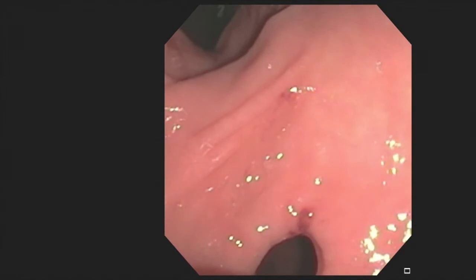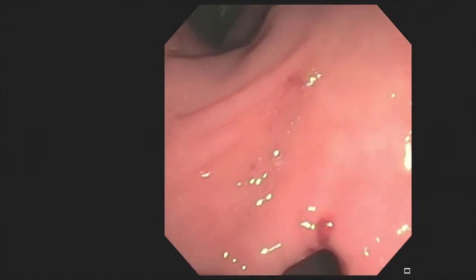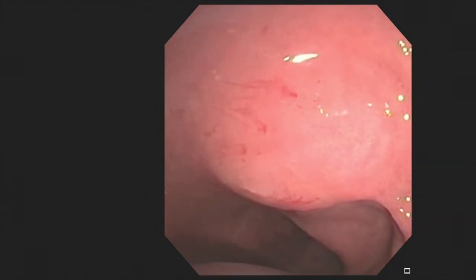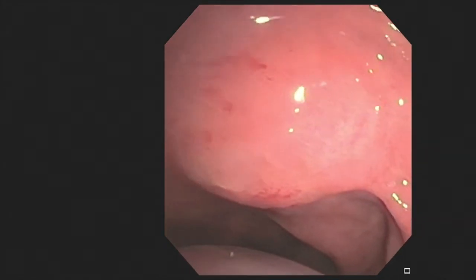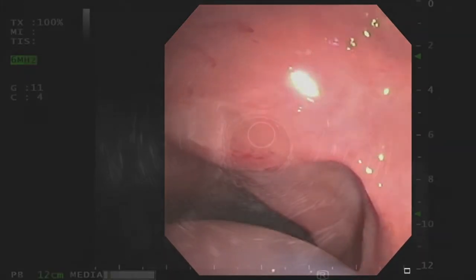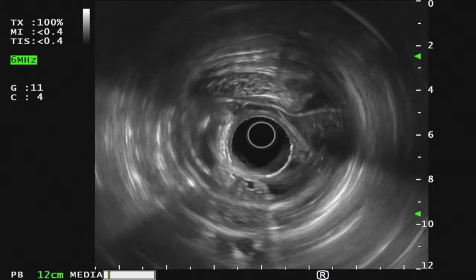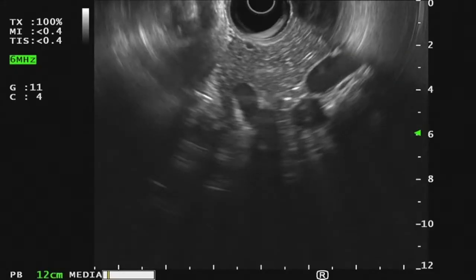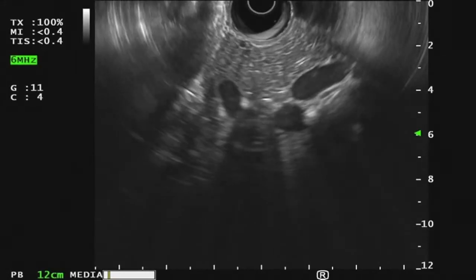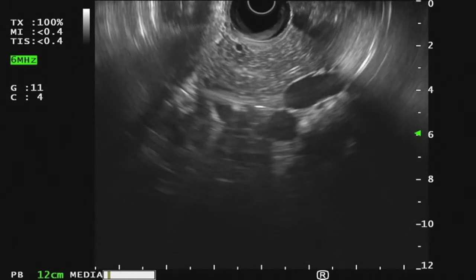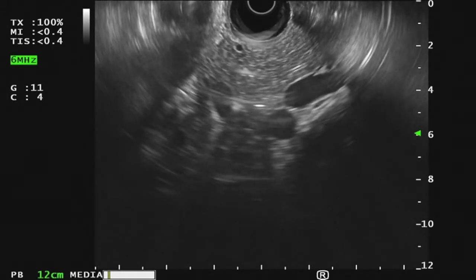The echoendoscope was advanced to the duodenal bulb, where the subepithelial lesion was visualised. On EUS examination of the area of the subepithelial bulge, a normal appearing pancreatic parenchyma was visualised without clear visualisation of the subepithelial lesion itself.